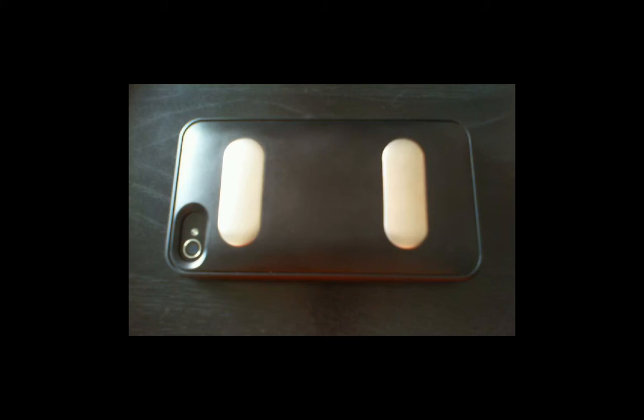If your veterinary heart monitor case is attached to your iPhone, but the app is no longer recording any ECG data, it is possible that the battery in your heart monitor is dead. To replace your battery, remove your iPhone from the heart monitor case.